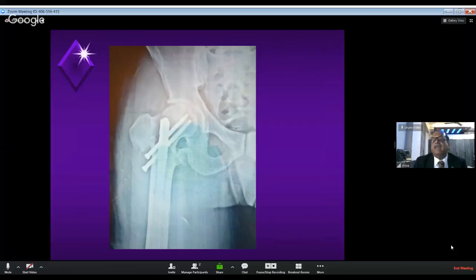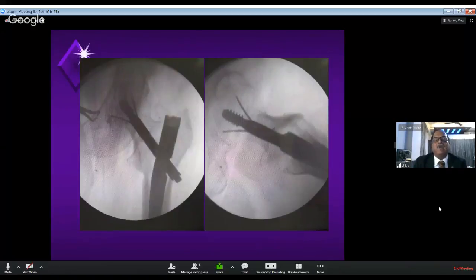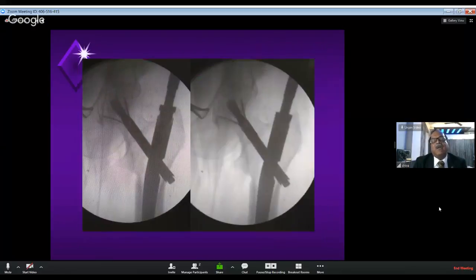So many of the nails, especially the imported ones available in the market, come with an end cap. You should use the proper end cap. This is a picture on the left where you can see the tip of the nail is just at the level of the entry side. To build up, I used the end cap in this case, and the picture on the right shows that the tip of the nail is above the entry side, at least 5 millimeters above the entry side, so that rocking of the nail will not happen. It will be snugly fixed at that point. So that's also equally important.